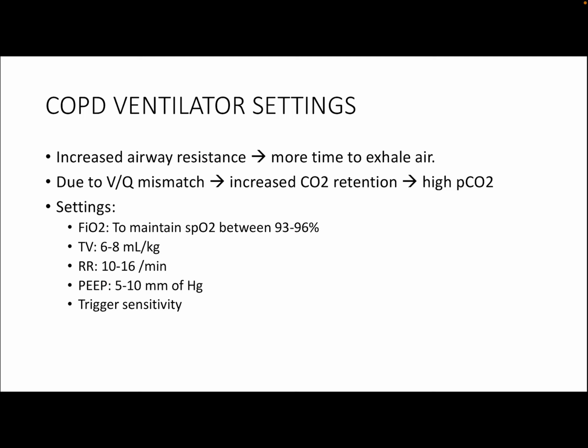Always note that in COPD patients, we start invasive mechanical ventilation only after a trial of non-invasive positive pressure ventilation like CPAP for 2 hours has failed. Only then do you start invasive mechanical ventilation. So in COPD, what happens?